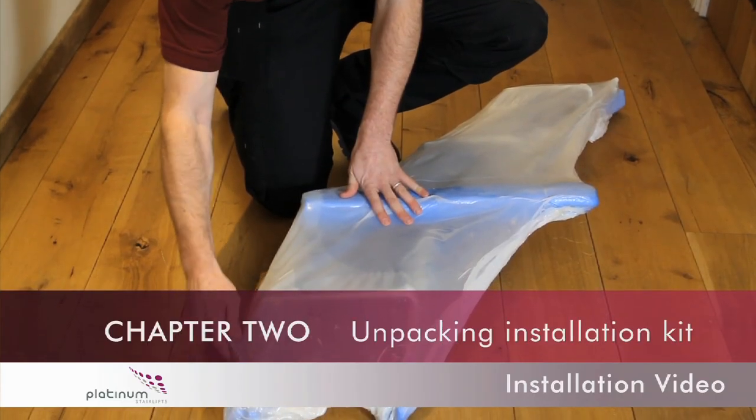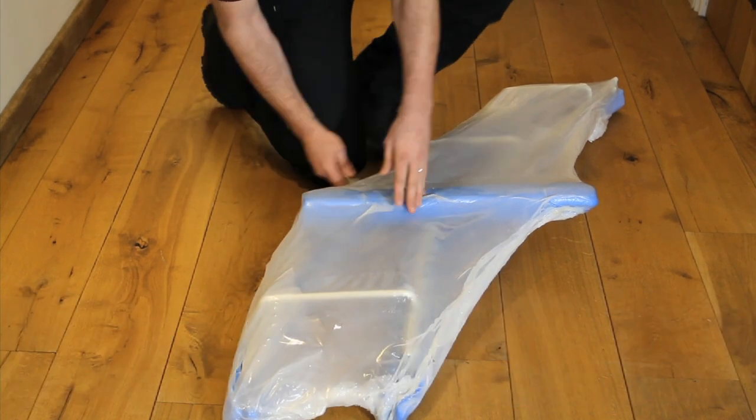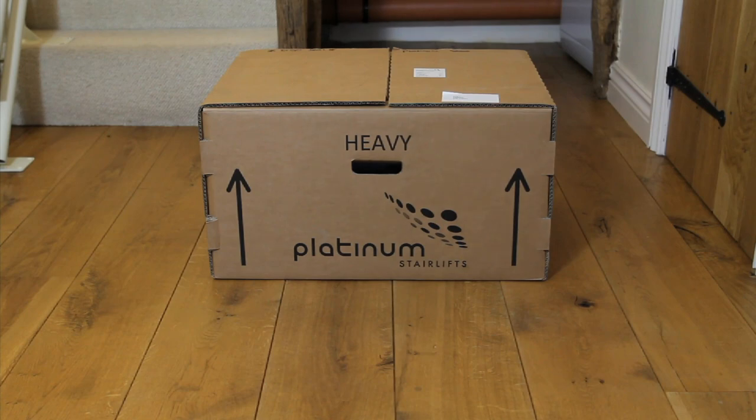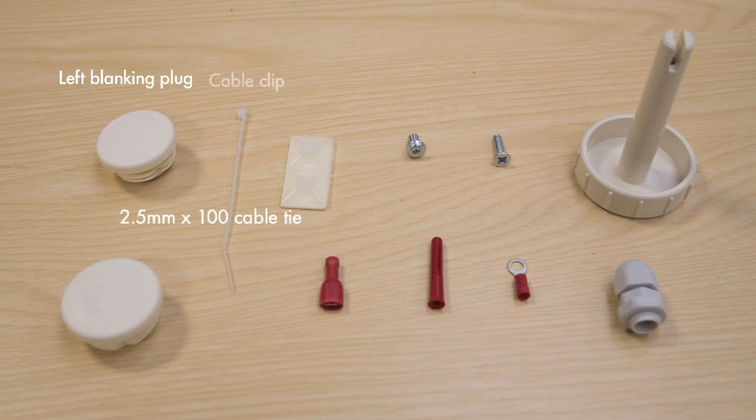Chapter 2: Unpacking of the Rails and Installation Kit. Before you start installing the stairlift, remove all of the contents from the installation kit and check everything against the drawing and the kit inventory.